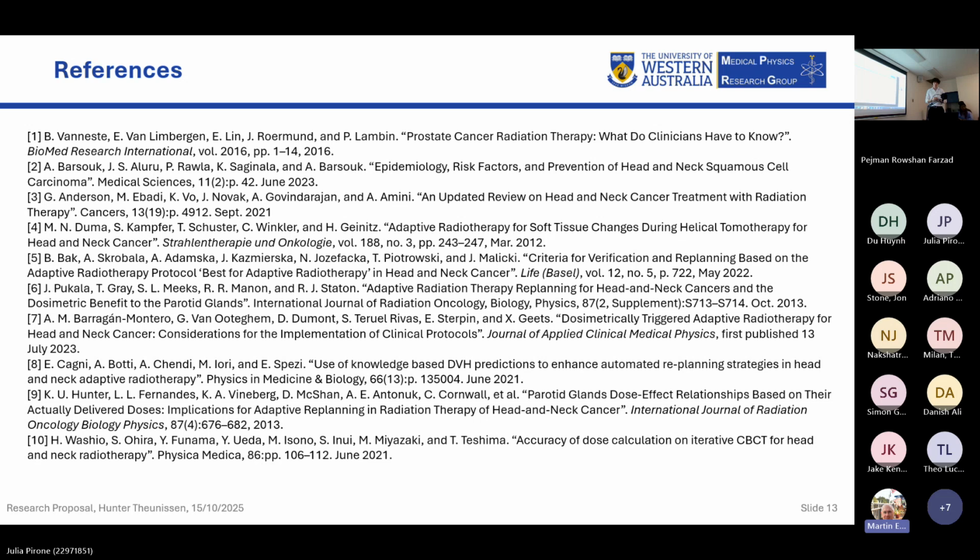So do you know what the clinicians currently are using to make that decision? Currently, for example, for the parotid glands, we wouldn't want any more than 20 gray received by a single parotid gland or 25 by both. So that is one clinical threshold that we could be discussing. There are a number more, such as spinal cord dose and the like.